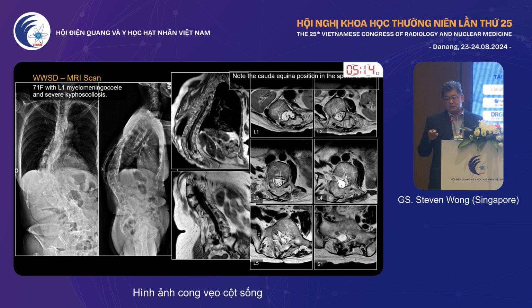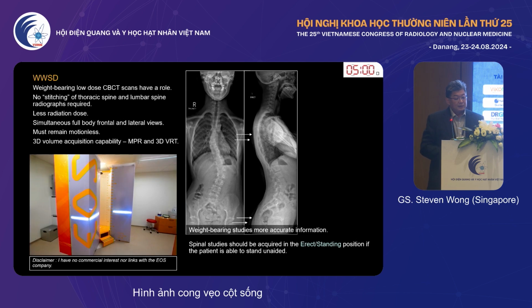So you do need to tell the surgeon, because you don't want him putting a drill through the thecal sac and into the cauda equina or the spinal cord when he does a stabilization, particularly in the thoracic spine.